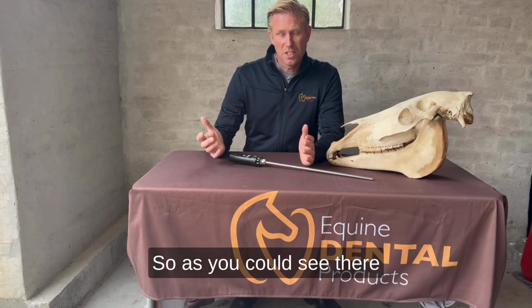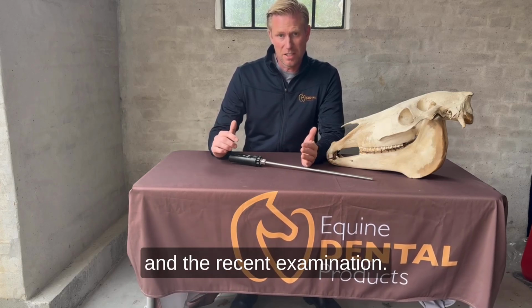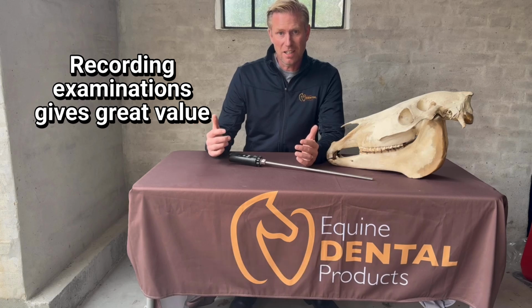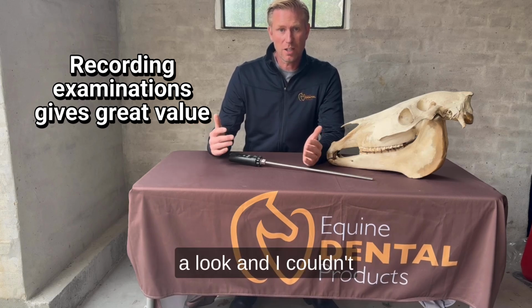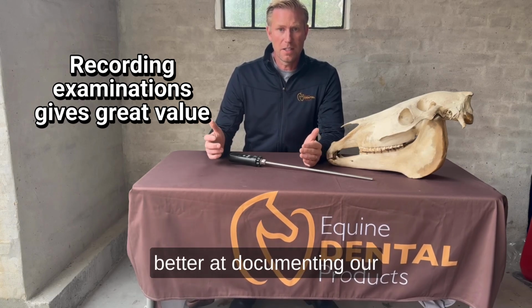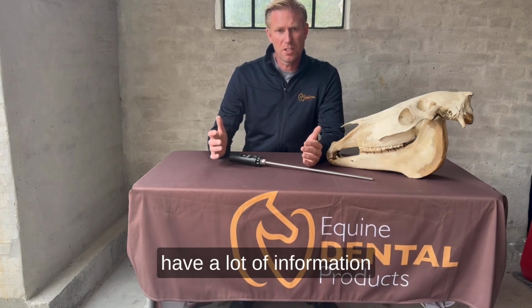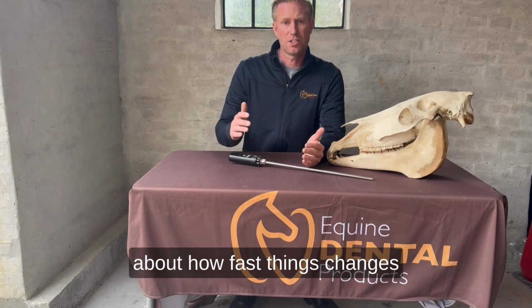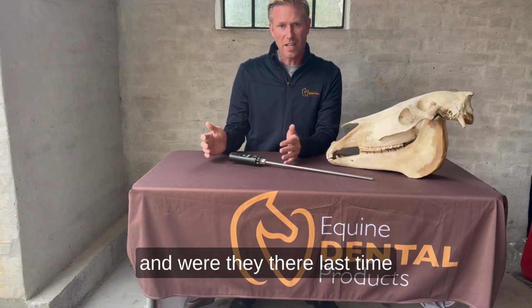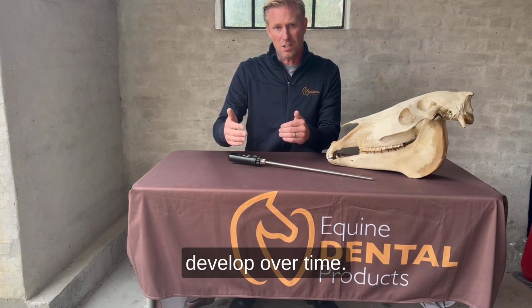Yeah, so as you could see, there was a huge difference between my last examination and the recent examination. And without having recorded my last examination, I couldn't go back and have a look, and I couldn't prove what has changed. And I think if we all were better at documenting our examinations, then we would have a lot of information about how fast things change and how fast we get open pulps, and whether they're lasting or not, and how much they develop over time.